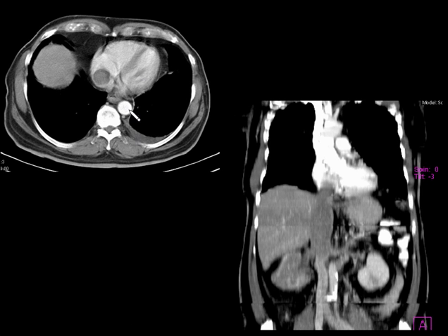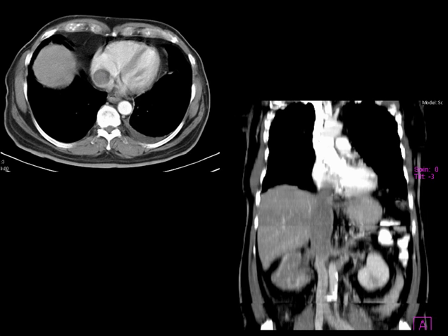Coming to the next case, you can see a heterogeneously enhancing mass lesion in the right kidney with renal vein thrombosis extending into the IVC and up to the right atrium. This is a classical case of renal cell carcinoma with tumor thrombus in the right renal vein extending into the IVC and up to the right atrium.